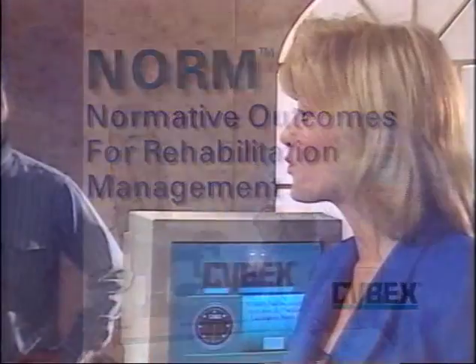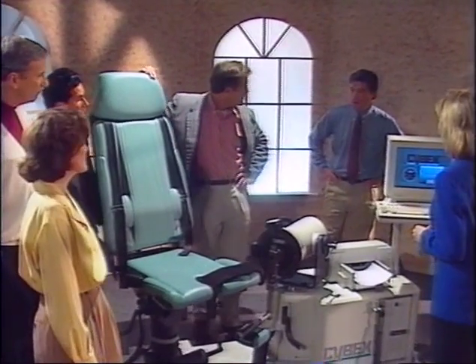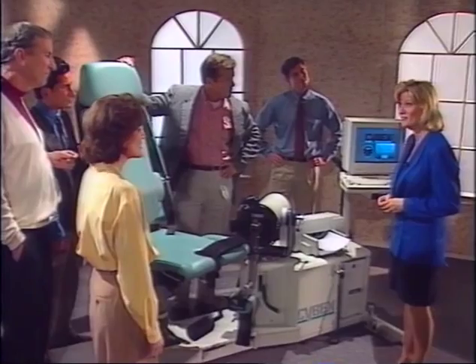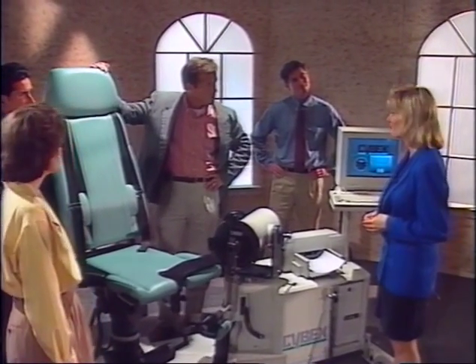The database is great for pre-placement physical capacity evaluations and return-to-work evaluations. The isokinetic database is constantly being added to and is the largest of its kind. It's a tremendous new area for growth. I like the modular design. What modes of operation are available with NORM? NORM has CPM, active assist, multiple angle isometrics, isokinetics, and concentric eccentric. All modes have automated protocol features as well as sequential programming capability.